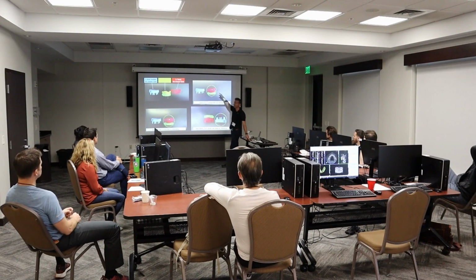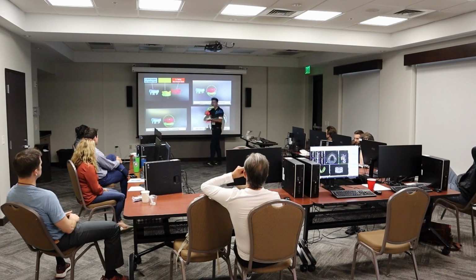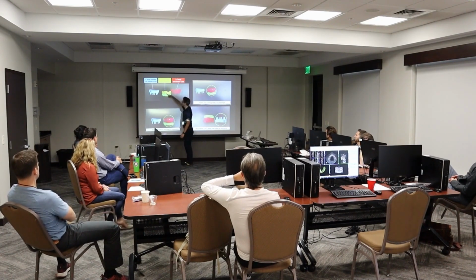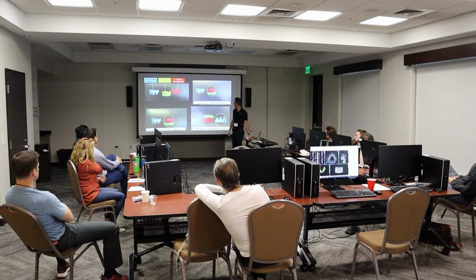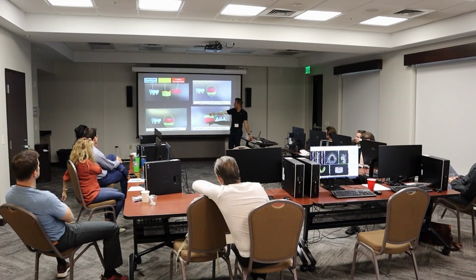Now, I did this manually. Obviously, the stitching process is actually like a snap using reference points. Yeah, I'm in Blue Sky, and I just screen recorded this because I wanted the concept of how we're getting all these together. But basically, we're taking this one and putting it on this one so that these teeth are matching up to those teeth, because that's our bite, remember? So now you have the cast stitched to the opposing.